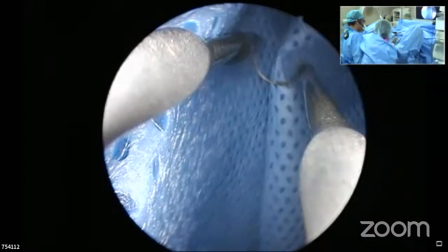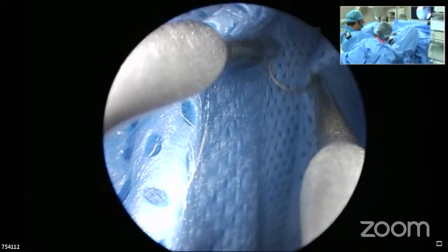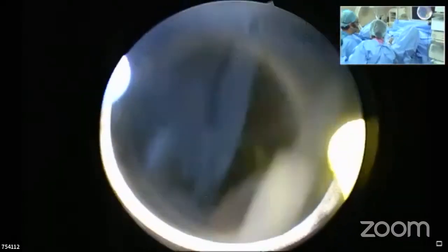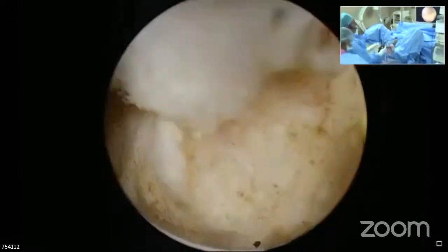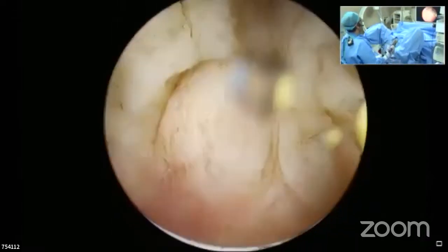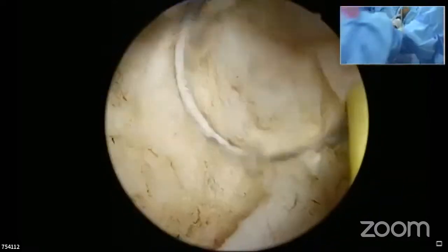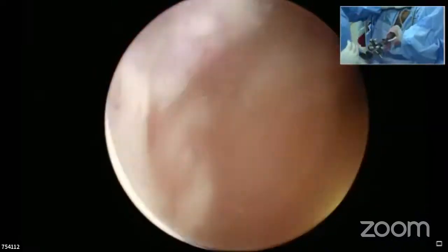One question by Prakash HS: is subcapsular better or total? I think it's always total orchidectomy. Subcapsular has the risk of leaving testicular tissue there. You can do epididymis-sparing orchidectomy, which gives the patient a feeling of something still there instead of a total orchidectomy. But as far as consent is concerned, it has to be orchidectomy consent.